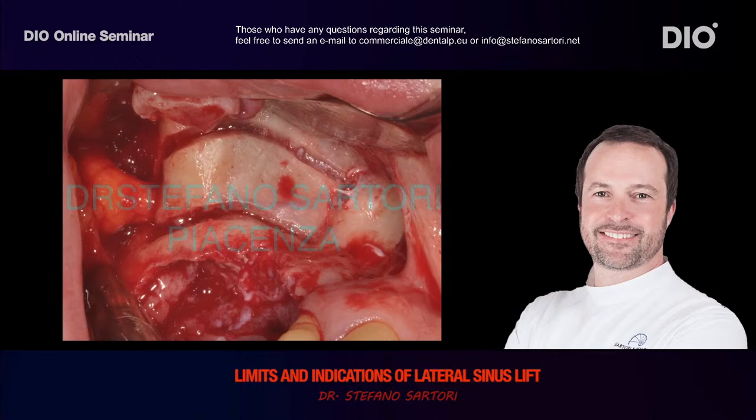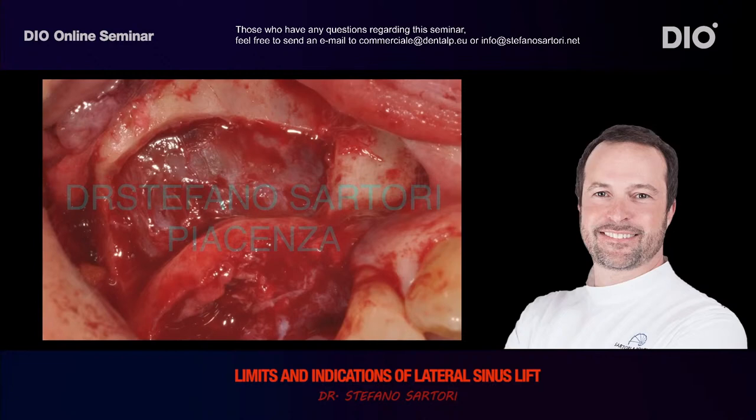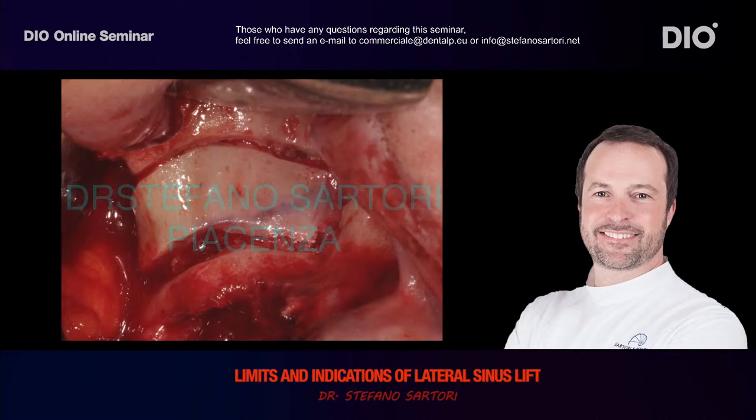So the surgery proceeds with the removing of the cortical buccal plate, the detachment and elevation of the Schneider membrane. Here you can see the cortical plate. The sinus was filled with fresh frozen homologous bone. Then the cortical plate was repositioned. And then you will see after the re-entry how we will have a complete restitutio ad integrum of this cortical plate. We won't see anymore the corticotomy line.